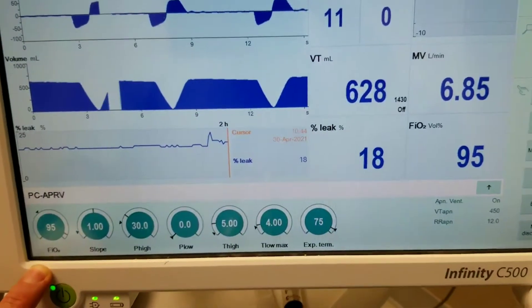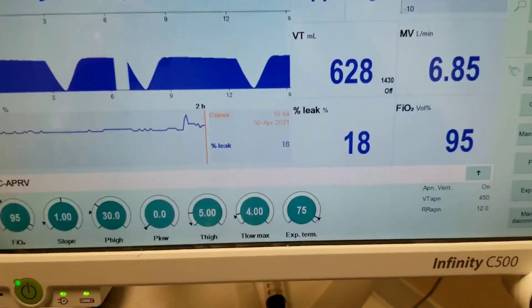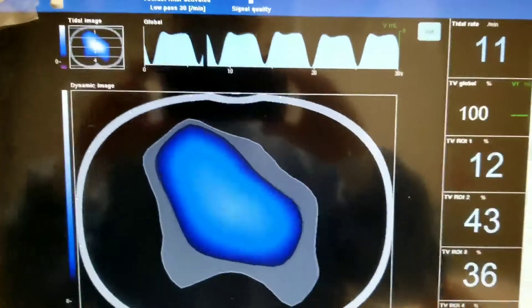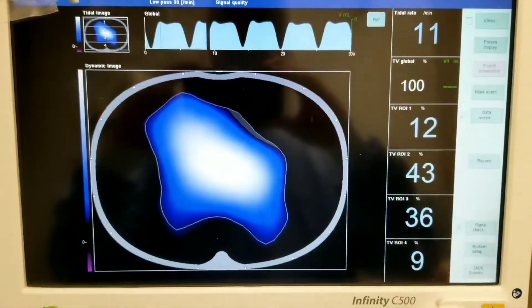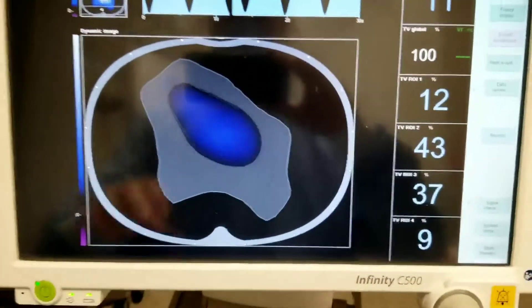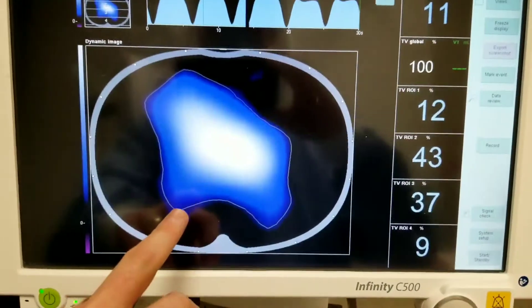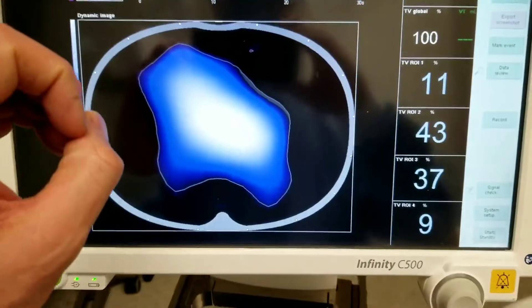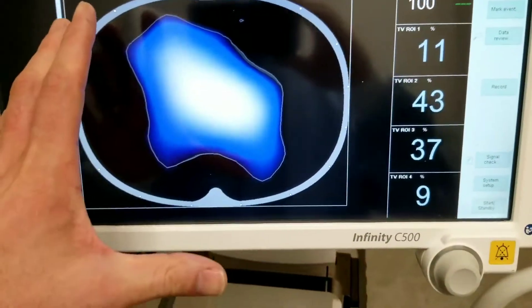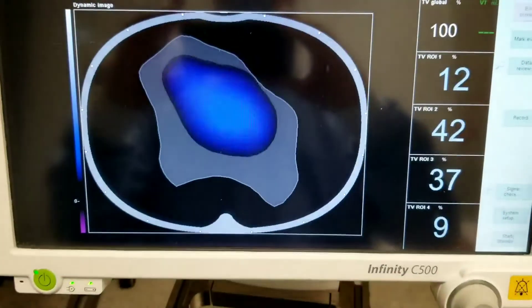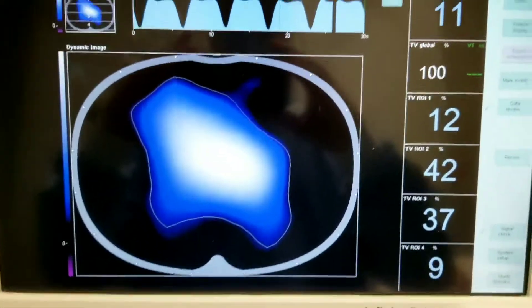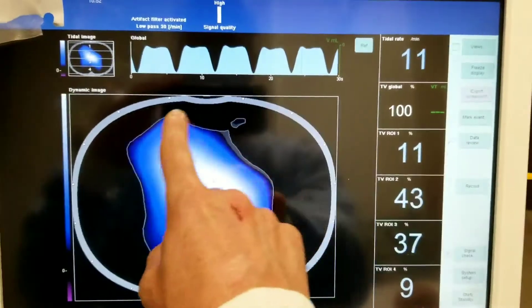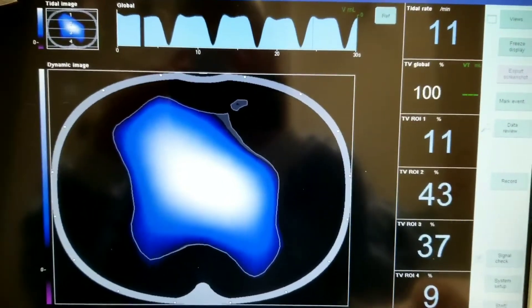Let's look at the tomography. This is what the electrical impedance tomography looks like when you're on APRV. You can see that while the P-high is being sustained, there's good recruitment — the aeration is staying right there. Let's look at the image a couple of times — it sustains. It looks like there's some missing aeration around this area.